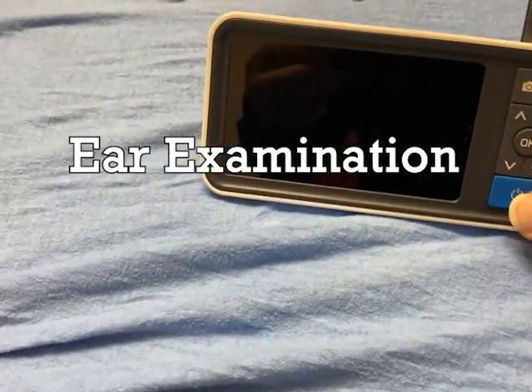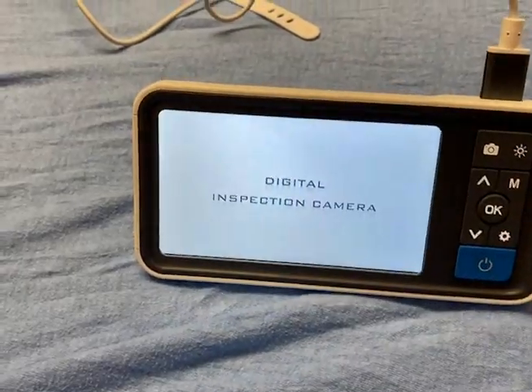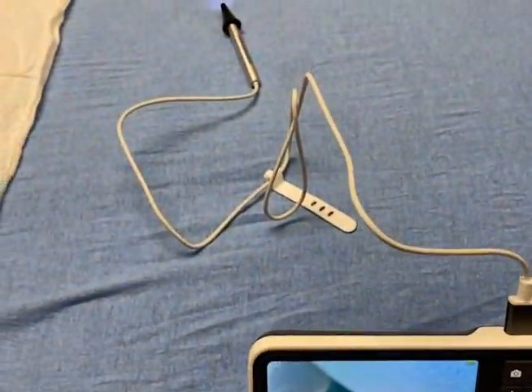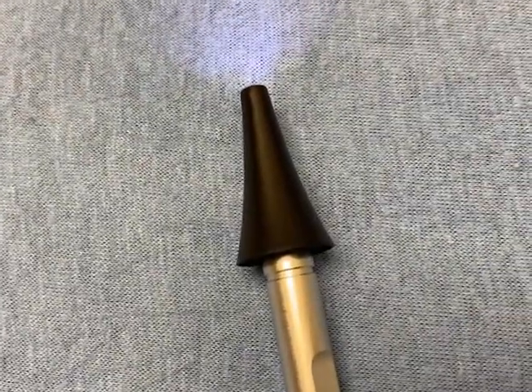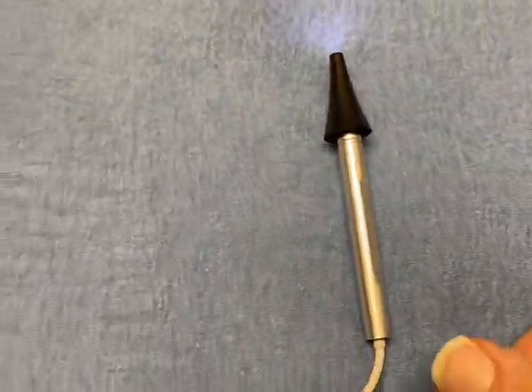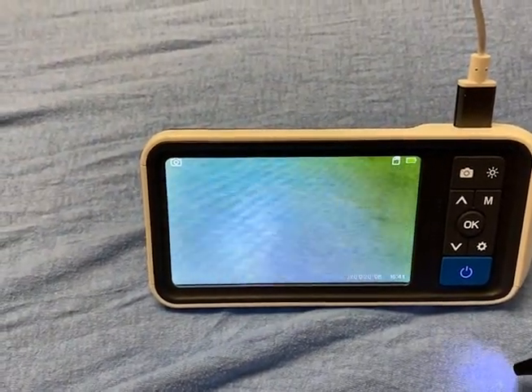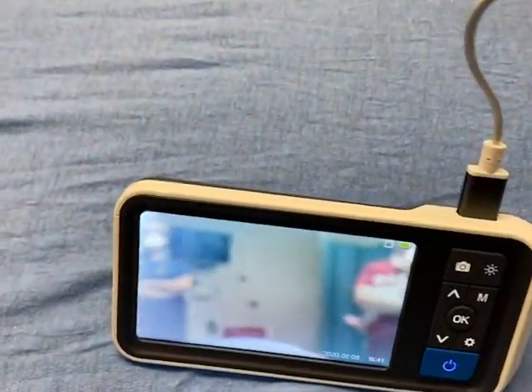All right, so we have this new little gadget that was sent to me, and we're going to demonstrate on this young man. It's basically a digital camera for examining ears. It's got this special ear speculum, and it also then has a special camera. And so this camera, as you can see here, gets pretty darn close. See that? And so we're gonna demonstrate it on examining this child's ears.